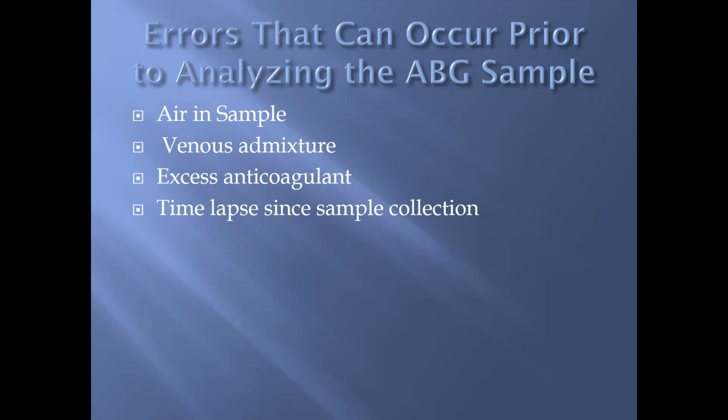when you lower the temperature of the blood, you stop the blood from consuming the oxygen, because oxygen levels will decrease in blood. If you analyze it after 30 minutes, after an hour, after 2 hours, you'll notice the amount of oxygen keeps going down.